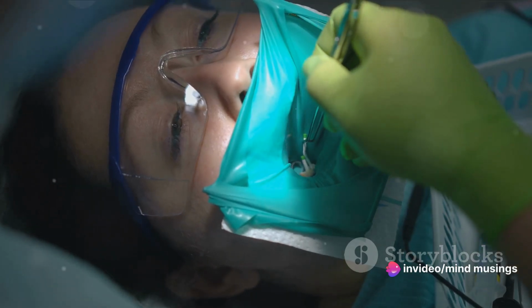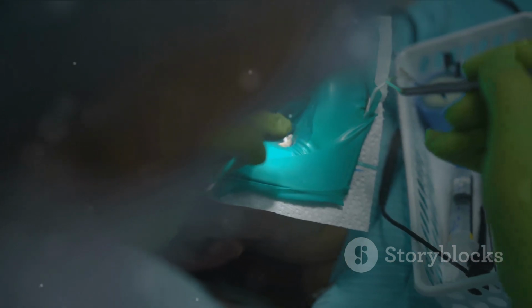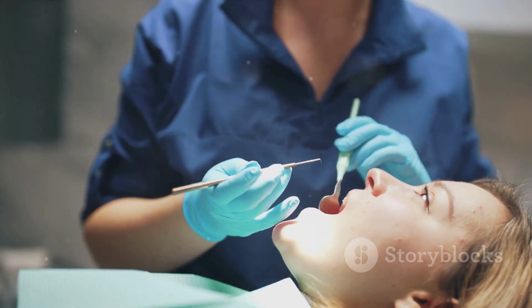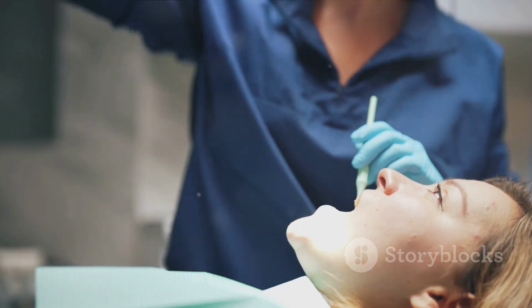A test cavity is filled temporarily after the procedure, and a follow-up appointment is scheduled to plan further treatment if required. Appreciate the precision and care that goes into the field of endodontics. Each procedure, including the test cavity, is meticulously designed to ensure your oral health is never compromised.